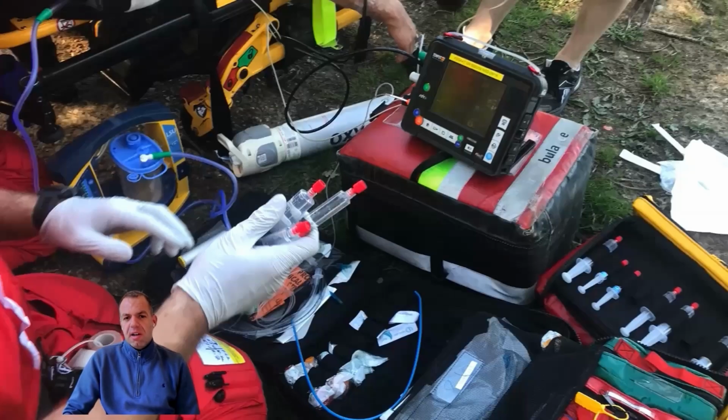And this is how we set up for our anesthetic. So we have pre-drawn syringes full of the anesthetic medication. And you can see here our Tempus monitor is absolutely central to the procedure, literally in the middle of what we call the kit dump area, where we're setting up the anesthetic. Now this is important for several reasons. Firstly, we need to be able to see the physiology, as we've talked about, but that physiology can change very, very quickly, particularly when you're giving someone an anesthetic. We need to know immediately if there's any change in their oxygen level or their blood pressure changes, for example.